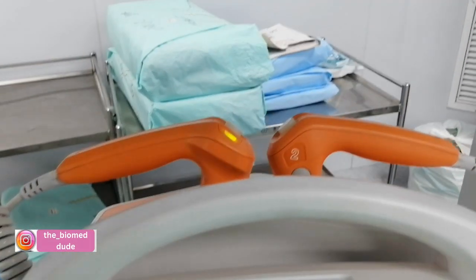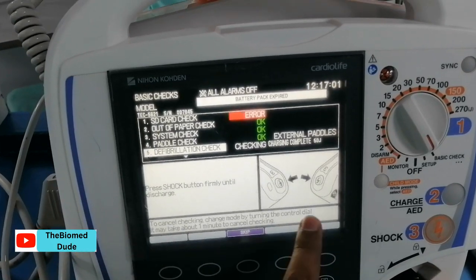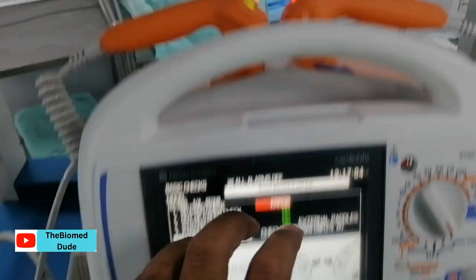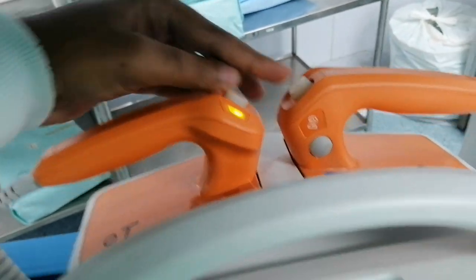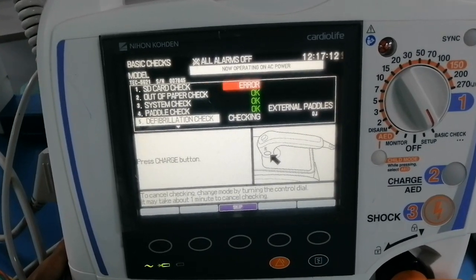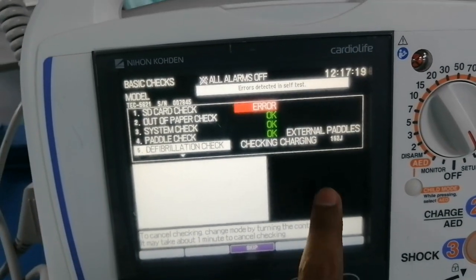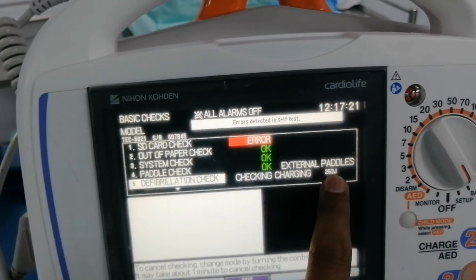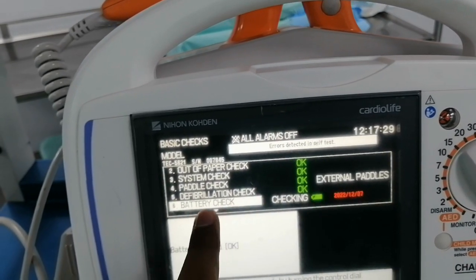The paddle is confirmed okay. The next action is the defibrillator check — I press the charge button to check the defibrillator charging function. Then I discharge using both switches. Defibrillator charging and discharging are checked. I press the charge button again and press to indicate the maximum joules. All paddles are checked. Now the battery check — I press okay.